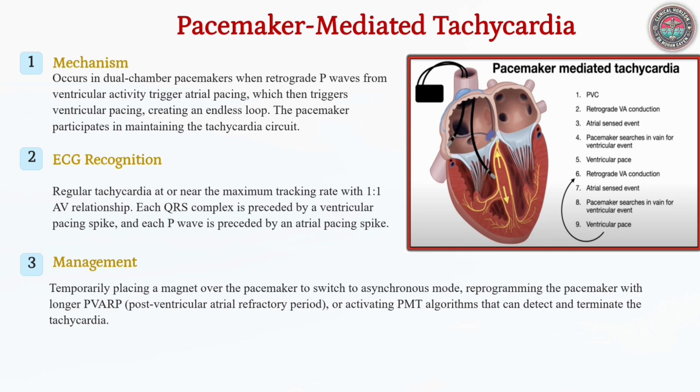Management involves placing a magnet over the pacemaker to switch to an asynchronous mode, reprogramming the post-ventricular atrial refractory period, or PVARP, or activating PMT suppression algorithms to interrupt the tachycardia circuit.